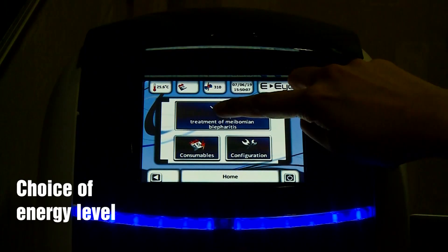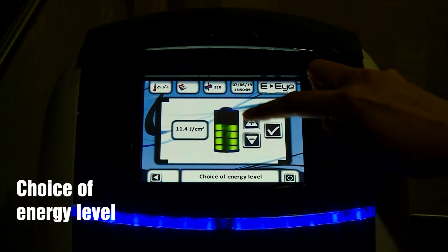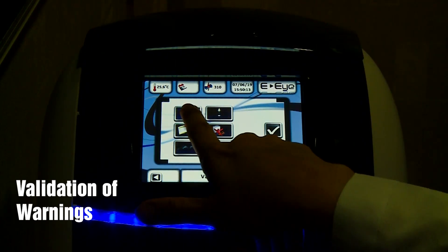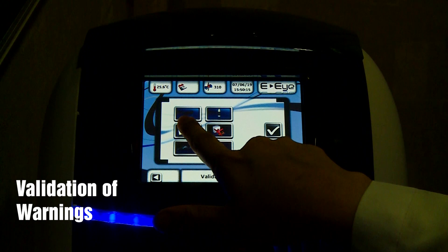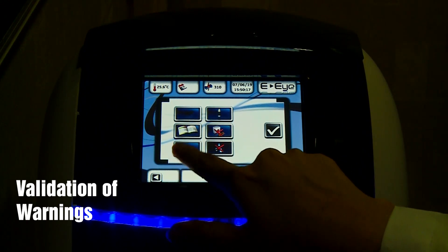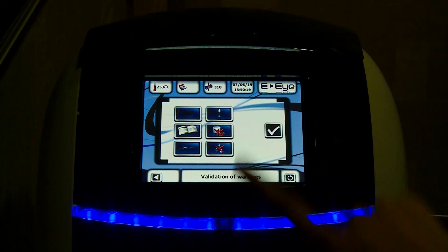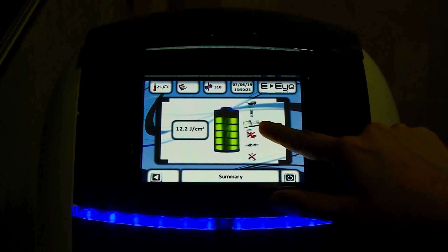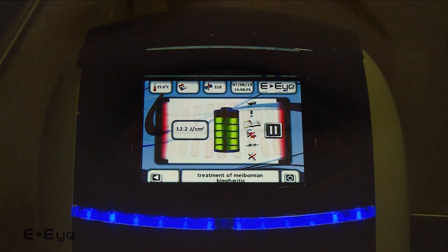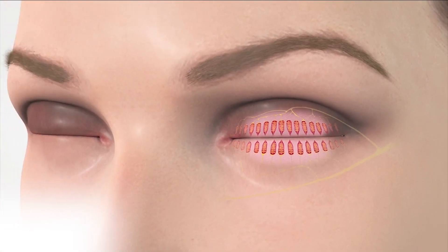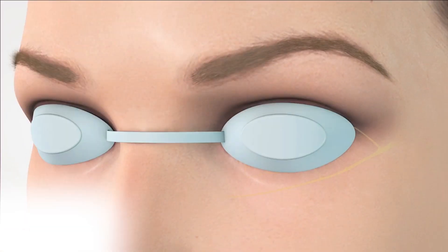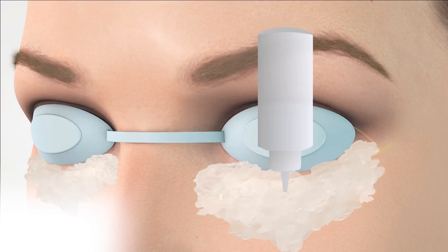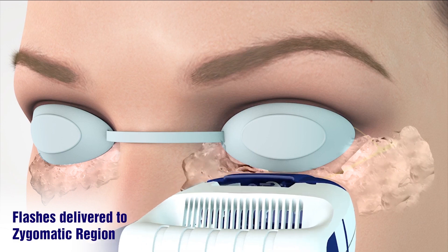We start with choosing the desired energy level decided by the skin tone of the patient. It is important to validate the warnings prior to starting the treatment. After putting an eye shield and application of jelly, the treatment involves applying flashes to the zygomatic region.